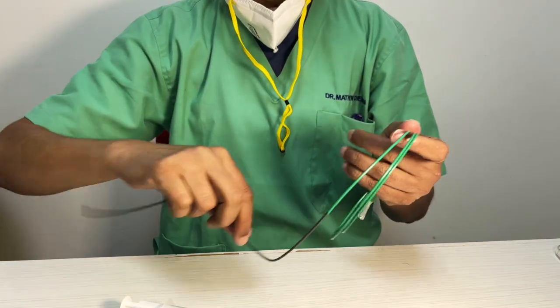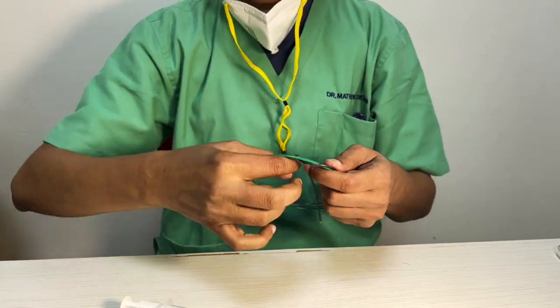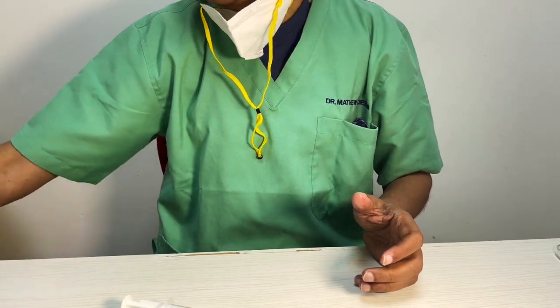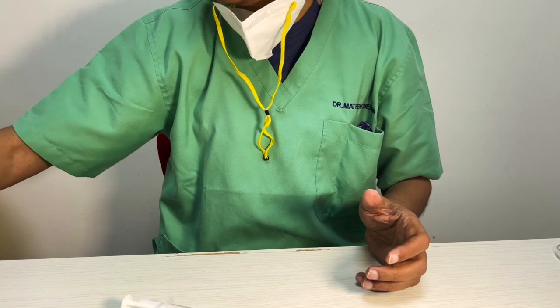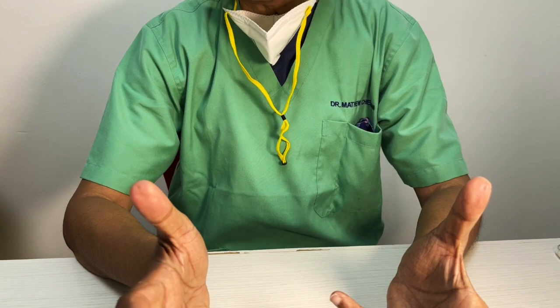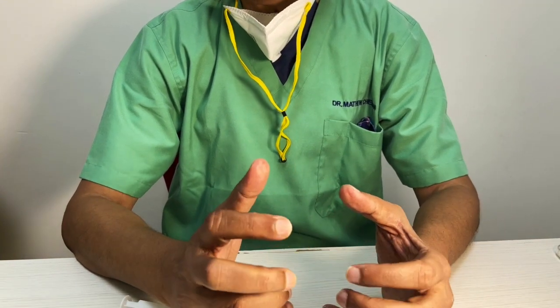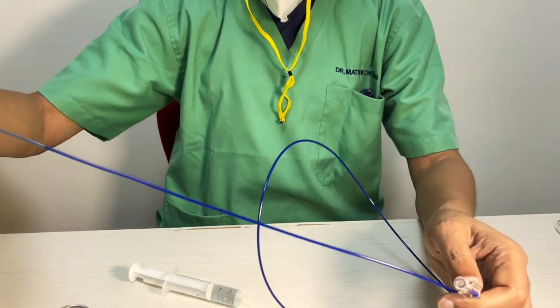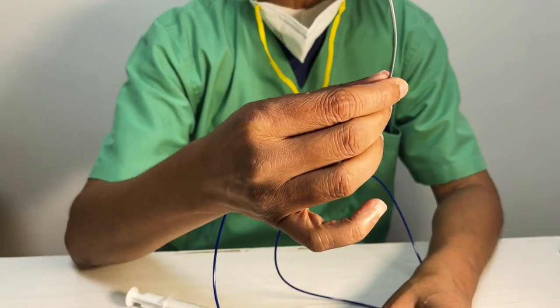Now someone may say, how then is Cat 7? Cat 7 works fine, but it still works on a helical braid. If I have a Cat 7, I'll just get one Cat 7 and show you also. Cat 7 is also a good catheter, but to me, in terms of technology, the best catheter that we have is the React. And I think that with time, we hope to see React proving itself to be the most trackable catheter and the most kink resistant.